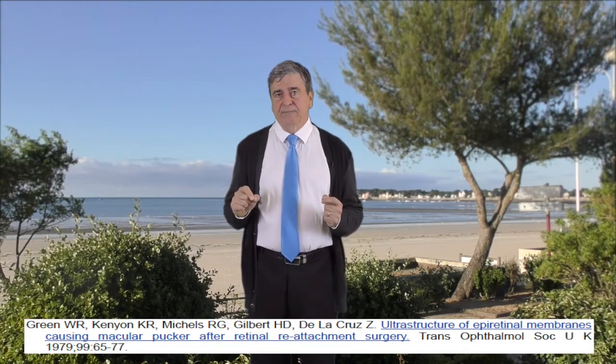They simply forget that when astrocytic proliferation has penetrated the hyaloid fibers, a simple PVD or a simple membrane removal leads in many cases, up to 75% of cases according to some authors, to the unintentional tearing of islands with tearing of the Müller cell end feet.